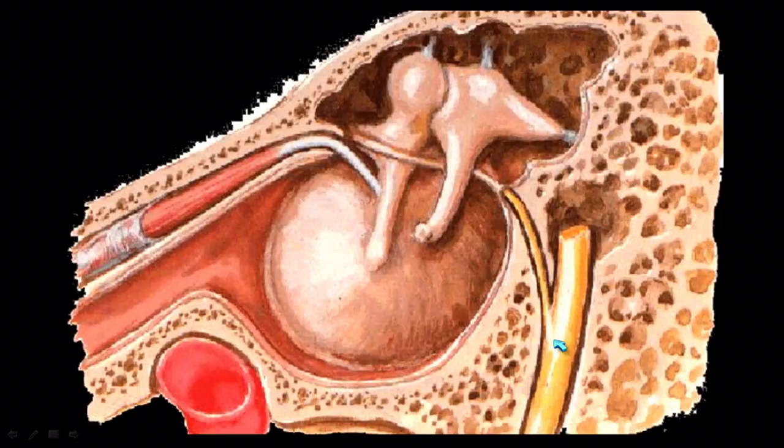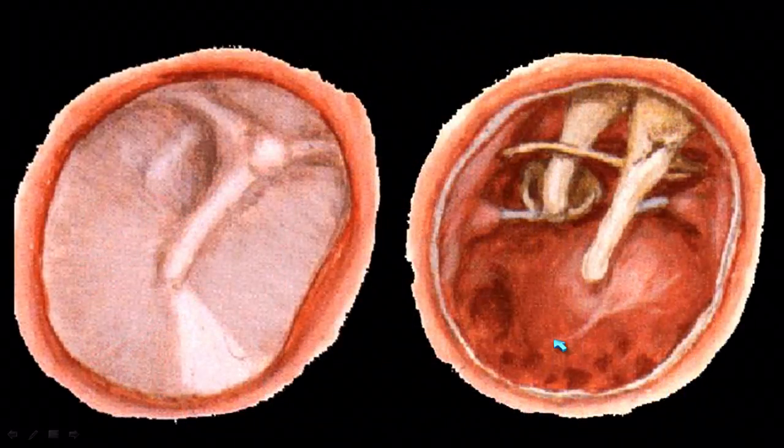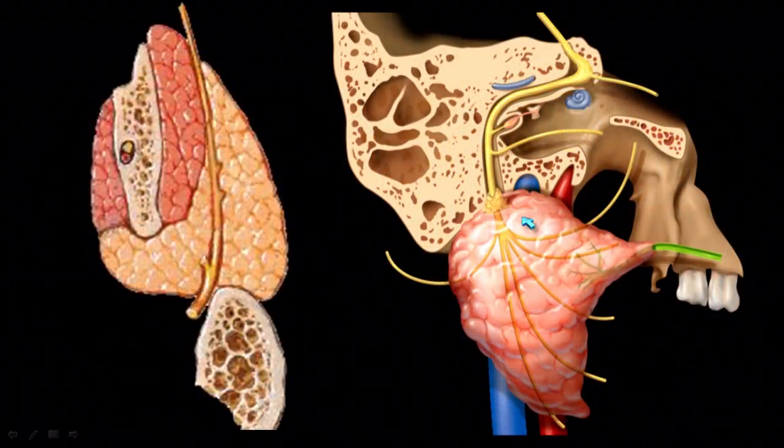So we have 2 branches coming off the descending or mastoid segment of the facial nerve. And here's just another picture of that. Here's our chorda tympani looping through, if we have a perforated eardrum, in between the malleus and the incus. And here's that little stapedius muscle going over the stapes. So both those 2 little muscles are helping clamp down those ossicles with loud noises so we don't just perforate our eardrum or the oval window.